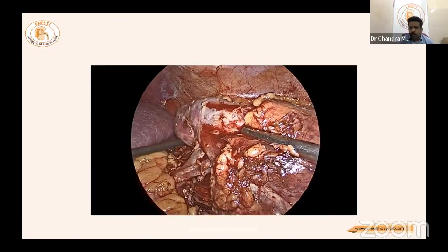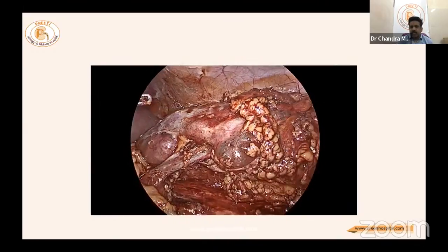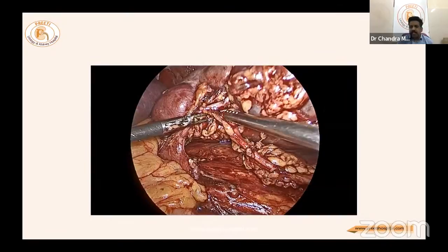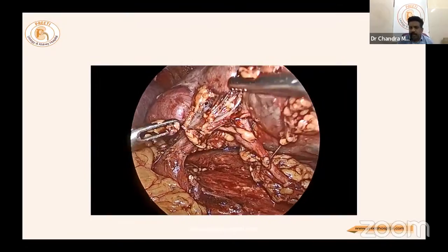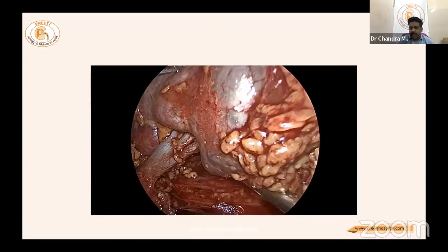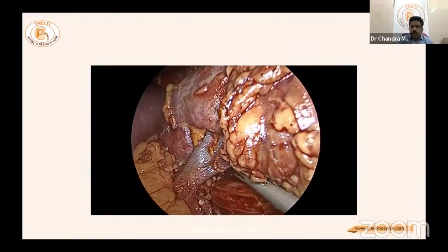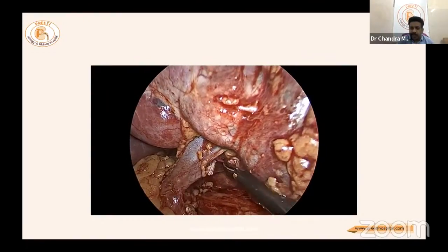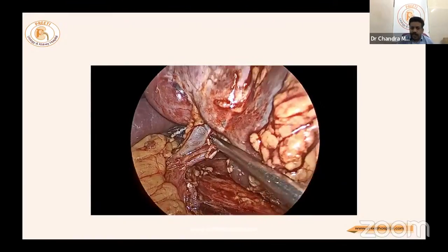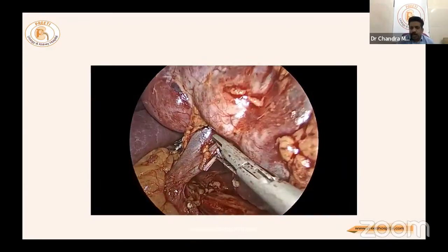Dropping the ureter with all fat and adventitial tissue, the pelvis is dissected — both posterior and anterior aspects. Any vein going to the lower pole can be safely clipped, but not the artery. The renal vein to the lower pole is divided; proceed slowly and meticulously. If the upper pole renal vein is injured, it results in nephrectomy.